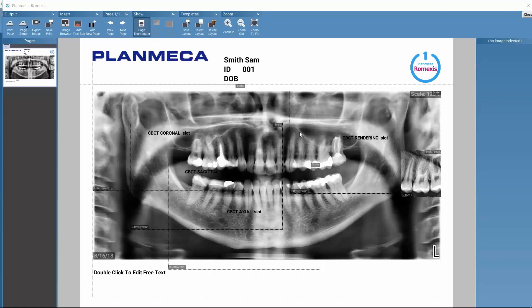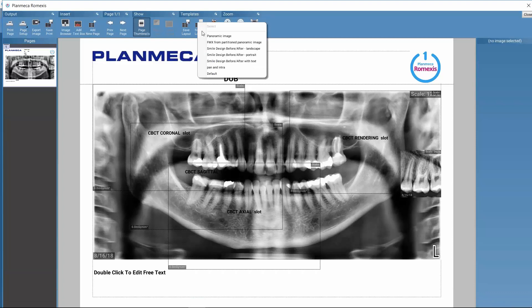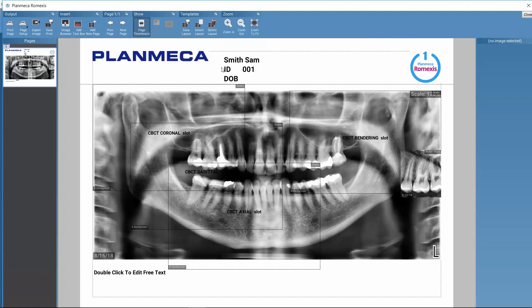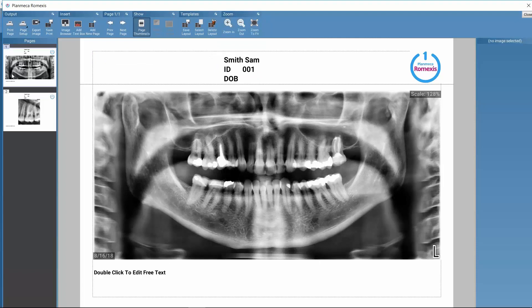Our images got opened in Print Editor — here we have our panoramic and then we have the intraoral image. I have here a default layout for images. There are predefined image slots for CBCT snapshots, so this is not optimal for this kind of image selection with a panoramic and intraoral image. But we can select another type of layout. I have previously defined a layout called 'Pan and Intra', with a slot for the panoramic image on the first page and a slot for the intraoral image on the second page. When I change the layout, these images find their places automatically.